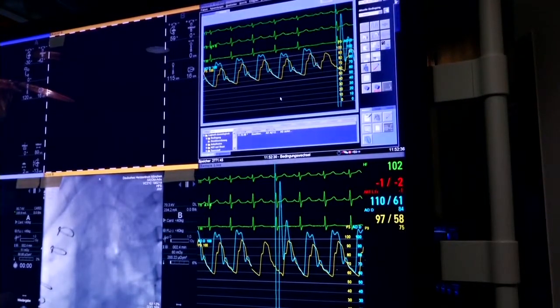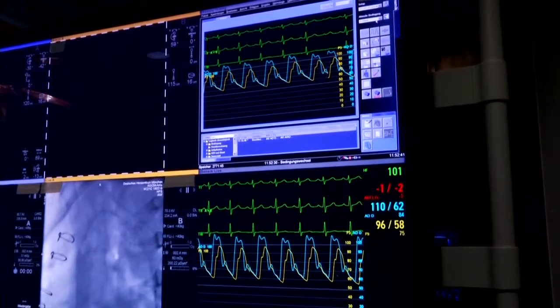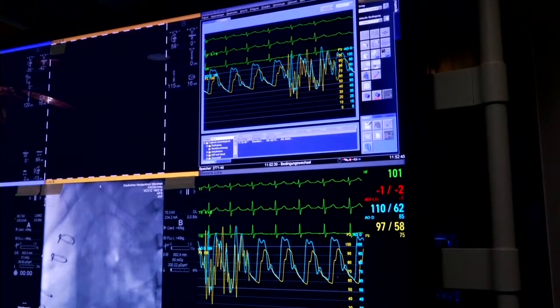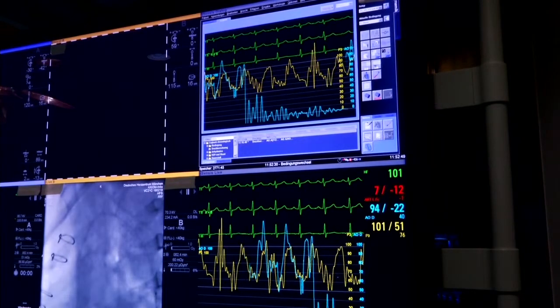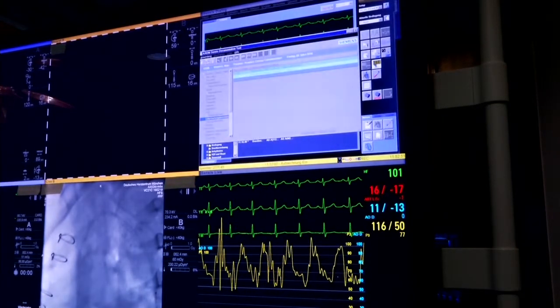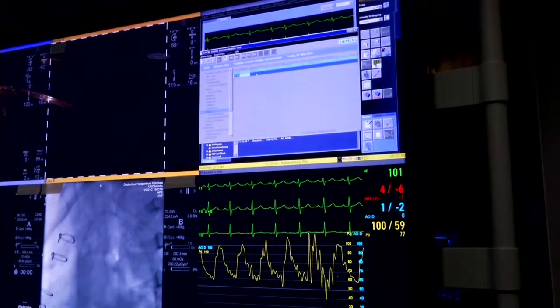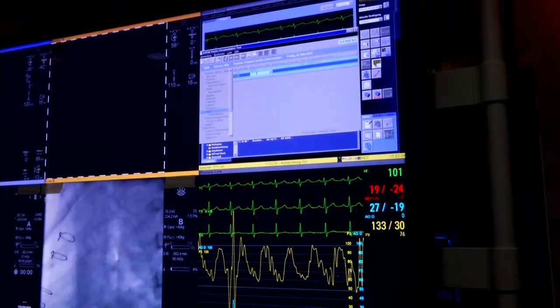Okay. So we have an angiography to see what's the reason for it and perhaps make a pullback. So if you go on with your program, you can come back to us later when we have the angiography and perhaps an analysis of where the residual gradient is. Is this fine with you, or would you want to stay with us? We have one more talk, so we can go ahead and do that. We will see you in about 15 minutes. Yeah, that's great. Okay.